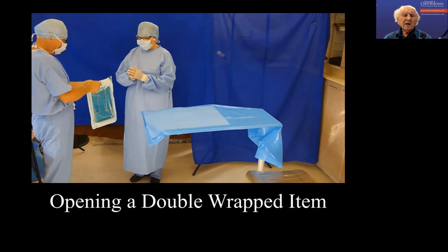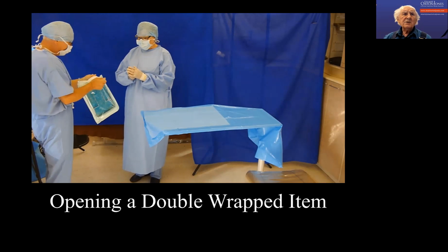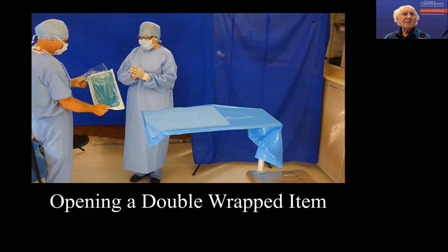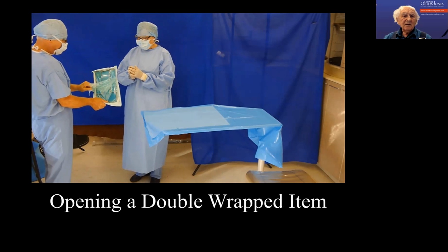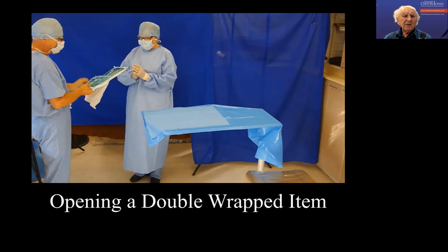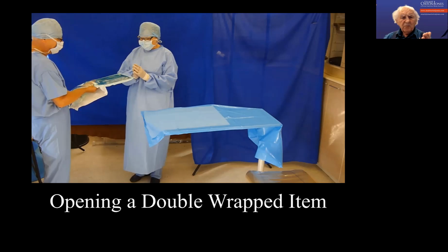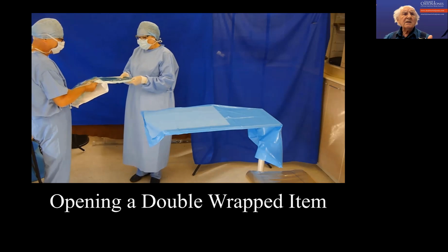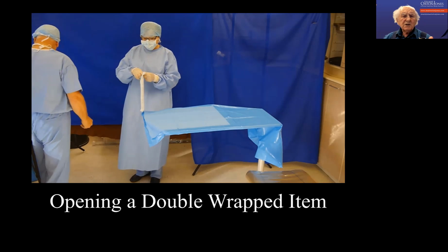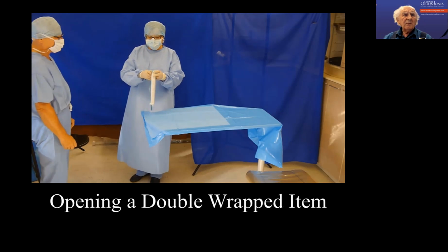Now, this is on the left there, a friend of mine who's an accountant. And he's just come to help me make these videos. And I've just taught him previously how to open a double bag without contaminating it with his hand. Now he's going to push it forward to indicate that the surgical assistant can take that from him.